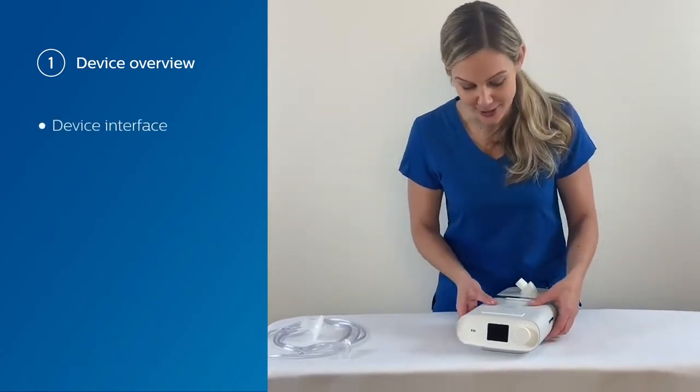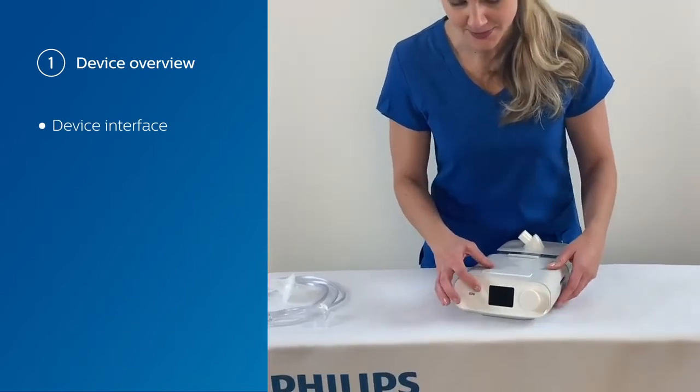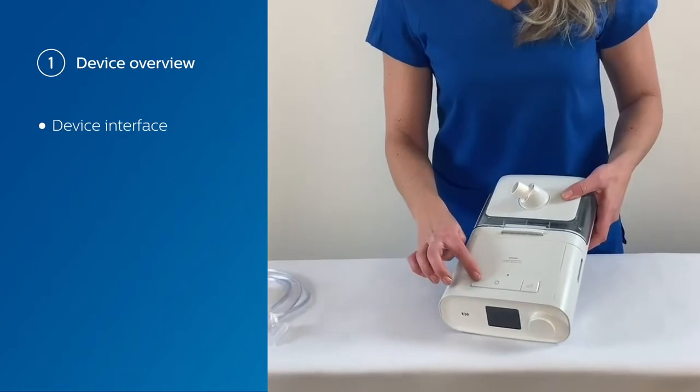The device itself, as you can see in the front, has a control dial, a screen, and on top a therapy on-off button.